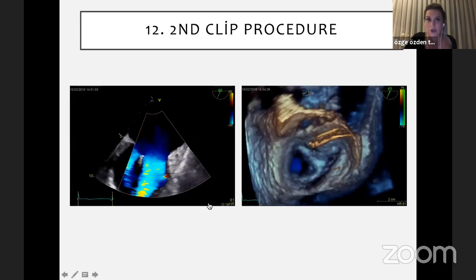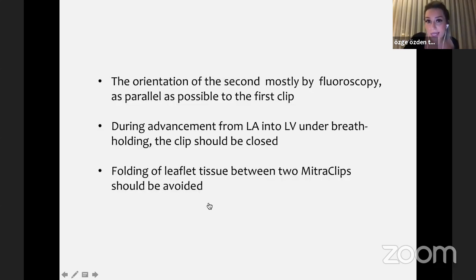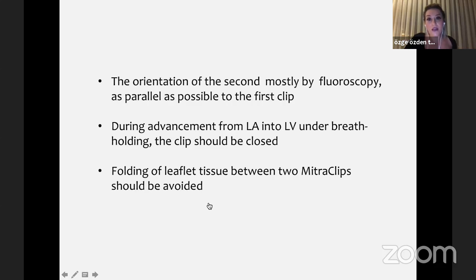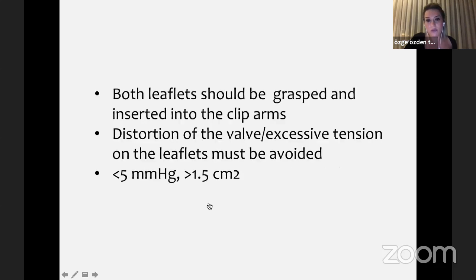After the first clip we proceed with the second clip. The orientation of the second clip is mostly guided by fluoroscopy, trying to be as parallel as possible to the first clip. Under breath holding — we ask our anesthesiologist for a breath hold — we close the second clip and send it into the left ventricle carefully. Folding of leaflet tissue between two MitraClip clips must be avoided, as it can create greater mitral regurgitation. Both leaflets should be grasped and inserted into the clip arms, and distortion and excessive tension must be avoided.